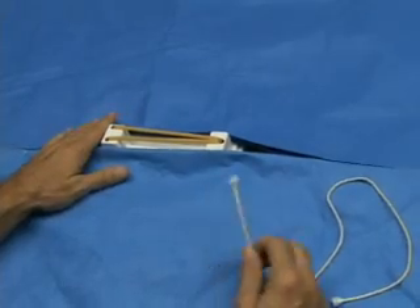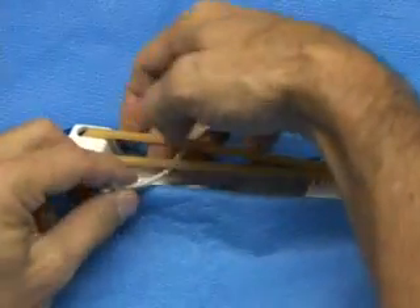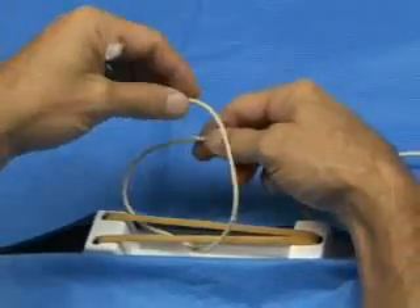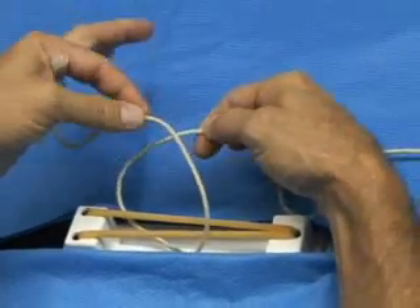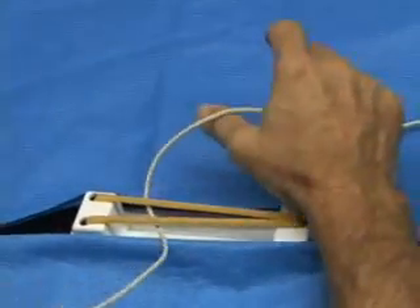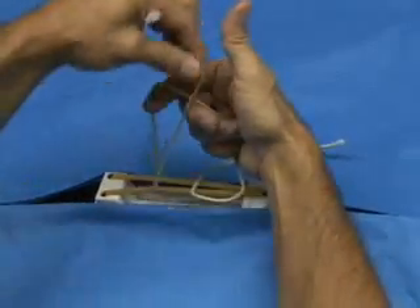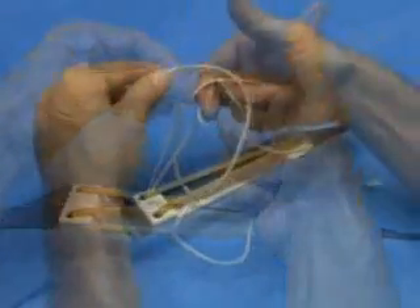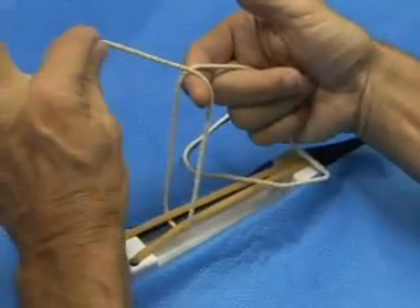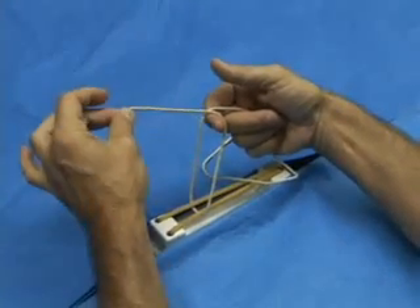The basic square knot has a couple of important elements. First, what we want to do is create a loop in the suture. We can do that easily with big heavy cord this way, but if you're using flimsy suture material you can't do it like this. What we have to do is create a loop over our finger. There is a loop — we're going to create a loop over the finger. Now our next task is to pass this strand around this strand to create our first knot.